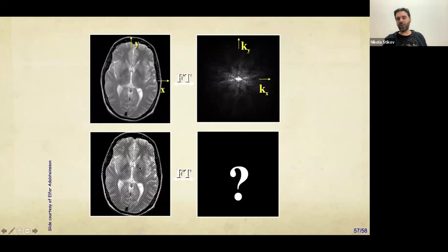And finally, this is an artifact that happens in MRI a lot. So basically, I'm acquiring a brain, and all of a sudden, I get this stripe pattern across it. And this stripe pattern, can anybody tell me what it is due to? It could be like a parasite RF impulsion or something. Yeah, exactly. I think that's Sandrine, right? Because she's seen that. So it is true. Often it is caused by just opening and closing a door of the MRI scanner, okay? And it turns out you do that at a specific point in time.